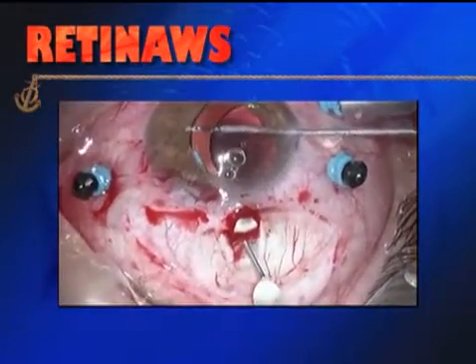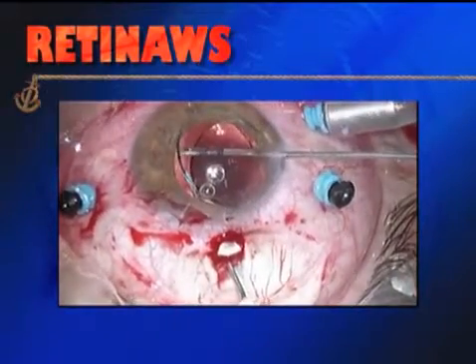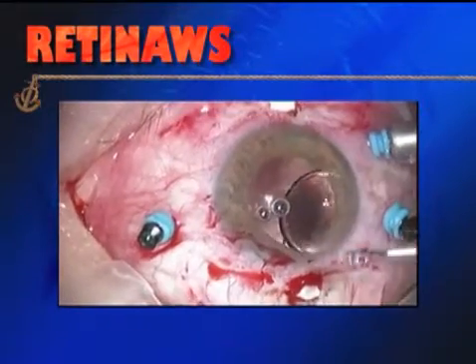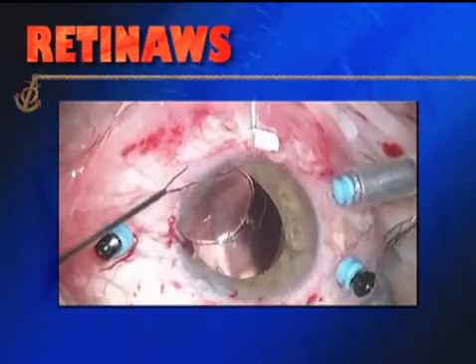the anterior chamber, I use an insulin needle as a guide to externalize the haptic at 12 o'clock, and in the same way I use the insulin needle at 6 o'clock to externalize the other haptic.